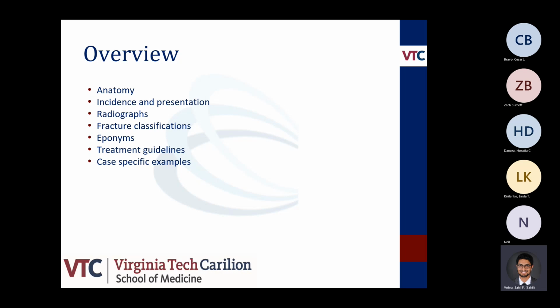And Neil and Zach, I'll probably have you guys just read a few x-rays for us and give us your thoughts later in the presentation here.